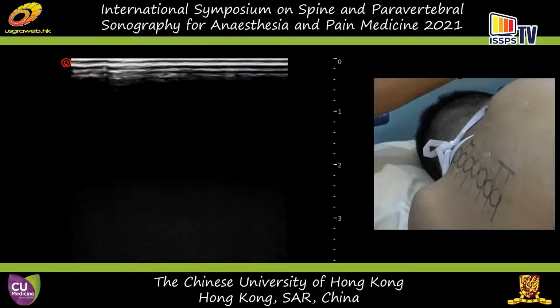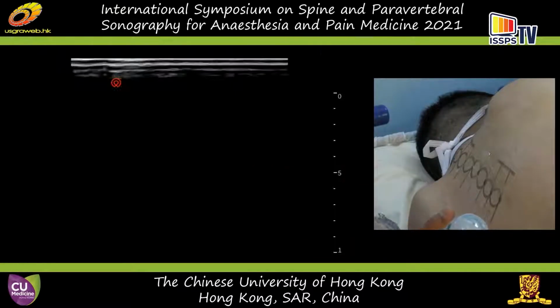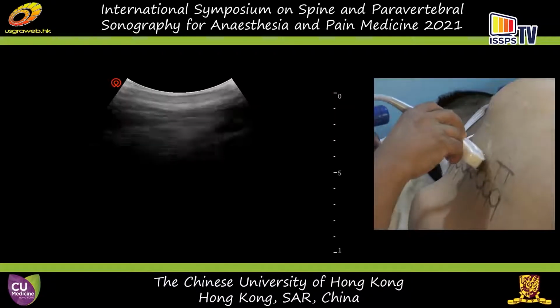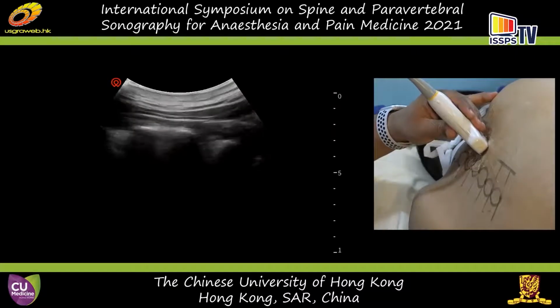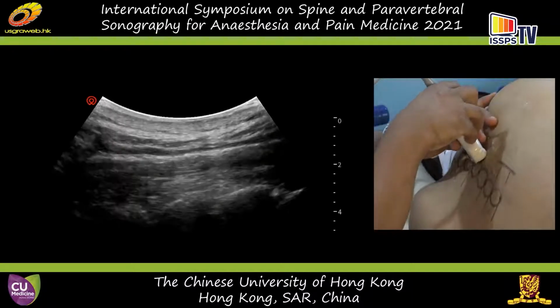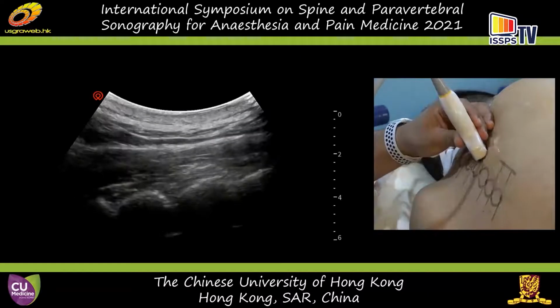So the take-home message is the linear probe, yes, it is a higher frequency, it's free, it should give you higher resolution, but sometimes the penetration and the image resolution that you get is quite limited. Now, the curved linear probe gives you extremely deep scanning, but you don't have to utilize the entire depth. We can actually reduce the depth. You can reduce the field of vision or the field of scan, so you can eliminate some of what you don't need.